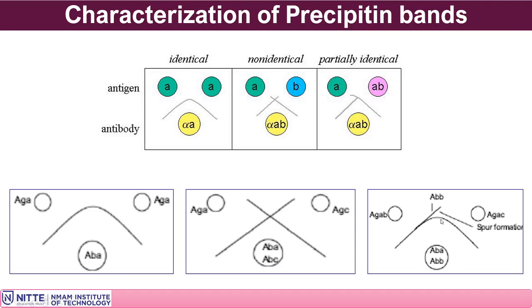And the antigen A precipitation band would have appeared smooth like this. Or if the concentration of B was less, it would have appeared very close to the antigen. So that also shows that depending on the concentration of antigen and antibody, if they are equal, then the precipitation band will be right in the middle between the two wells. But if the concentration of one of them is higher, the higher concentration substance will push the precipitation band towards the lower concentration.